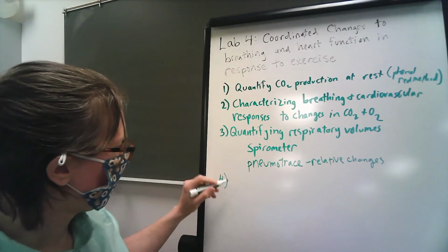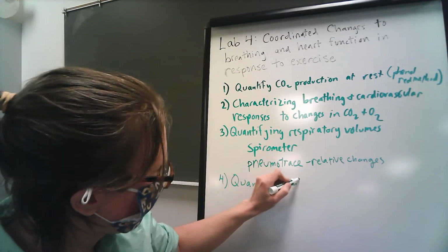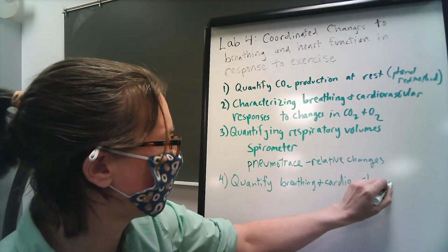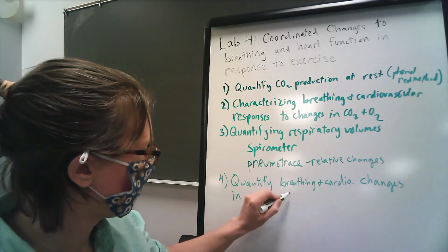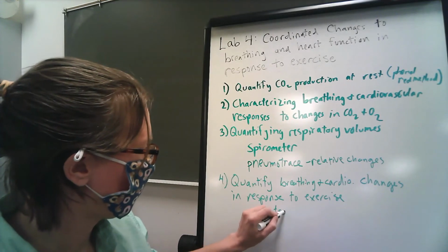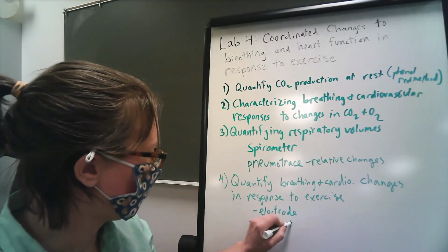And I've also shown you that you can quantify breathing and cardiovascular changes in response to exercise using a combination of a simple electrode setup and a pneumotrace.